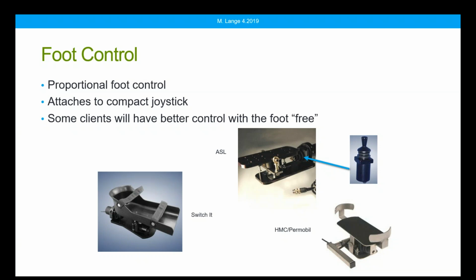Permobil umbrella. ASL, by the way, is underneath the Invacare umbrella, but any of these access methods that we're talking about are typically available on any manufacturer's chair. So just because ASL, for example, is underneath Invacare doesn't mean we can't use it on other chairs. Just because Movis is under Stealth, which is under Quantum Rehab, doesn't mean that a Stealth product can't be used on another manufacturer's chair. There are a few products that we're talking about here that only work on certain manufacturer's chairs, and when that is the case, I will definitely indicate that for you.